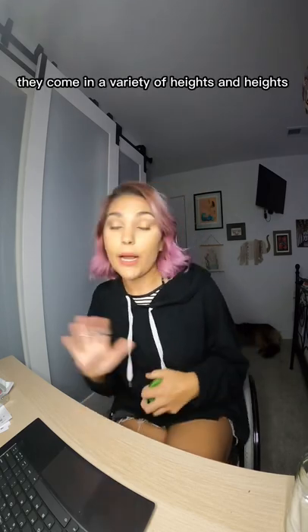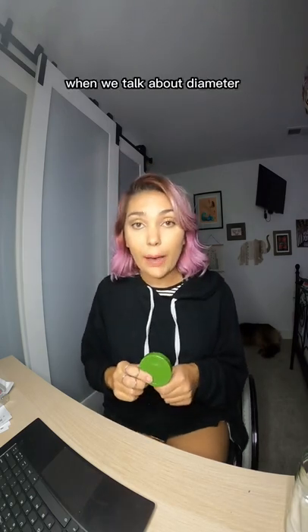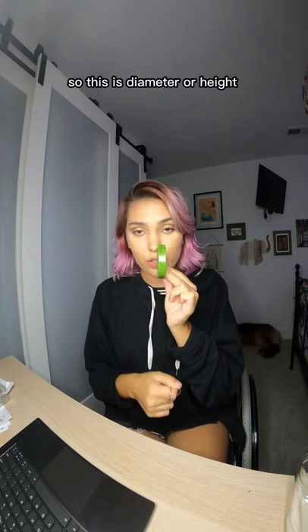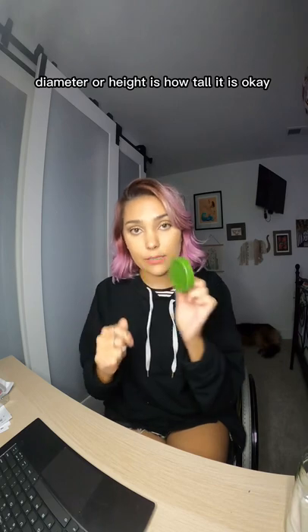Casters come in a variety of heights, diameters, and widths. Diameter is the measurement from one side to the other — how tall it is. Width is how thick the caster is. So: diameter or height is how tall, width is how thick.